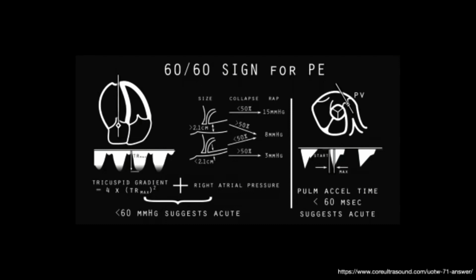But the last view in which we look for the highest tricuspid velocity is the subcostal view. In many instances, the tricuspid velocity is not evident to its fullest extent in those two standard views that I just talked to you about. So the American Society of Echo recommends that you also measure the tricuspid velocity in the subcostal view, especially when you have an eccentric jet that's directed towards the interatrial septum. If you're doing color Doppler, you will notice the direction of the jet, and if it's lined eccentrically towards the interatrial septum, you'll be able to pick up the highest TR velocity in that view.